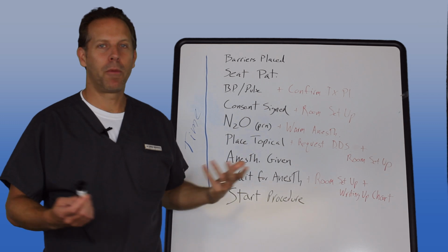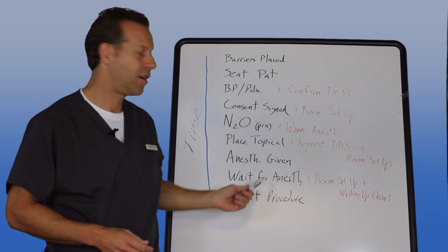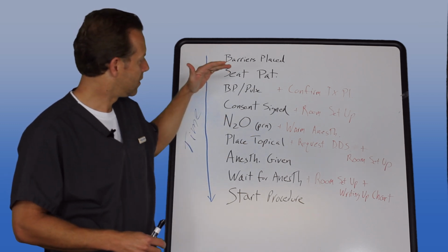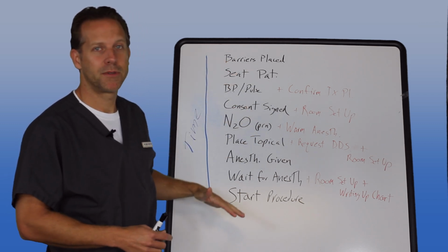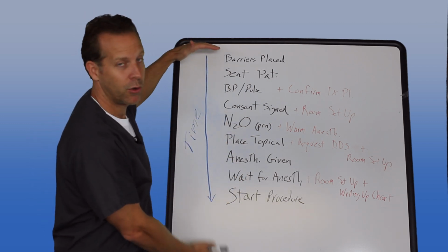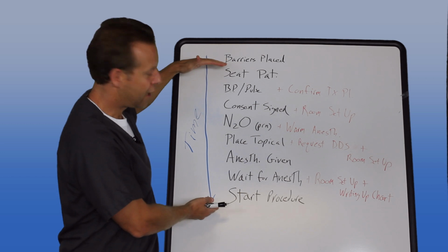Efficiency. It can be done in all parts of your office. What I've laid out here is how we do our room setups. Just taking this simple, repeatable set of steps and looking at how you can do more than one thing at a time, you can take the amount of time that would normally take for a procedure and shorten it.